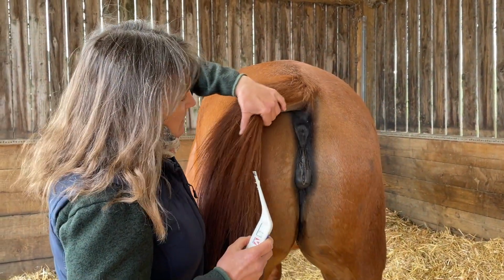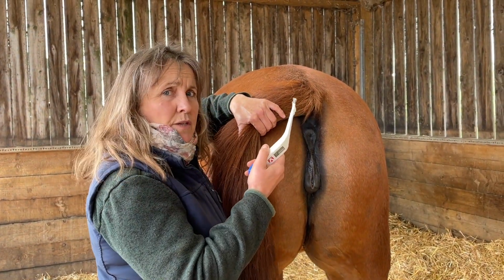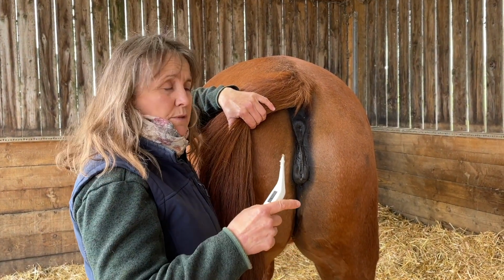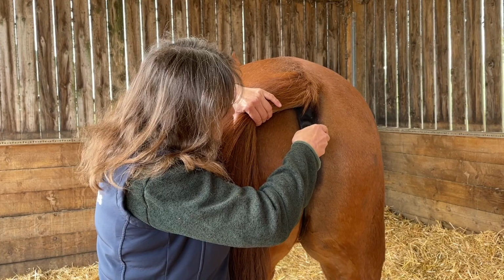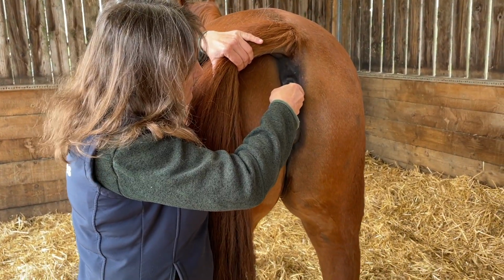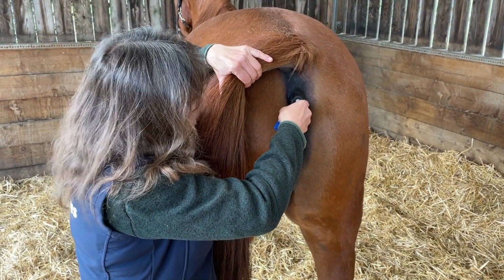Gently take the horse's tail to one side, and the bottom line is it's a sphincter muscle. It doesn't like things entering it, so you've got to be gentle, but at the same time there's got to be a little bit of purpose to what you're doing. So I will just gently put it there, and you can see how she's lifted her tail and is continuing to lift her tail as I gently rotate it and pop it in.